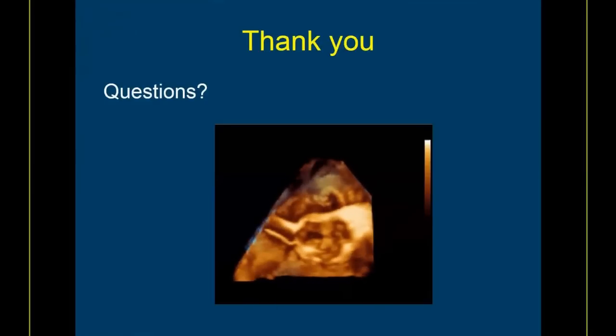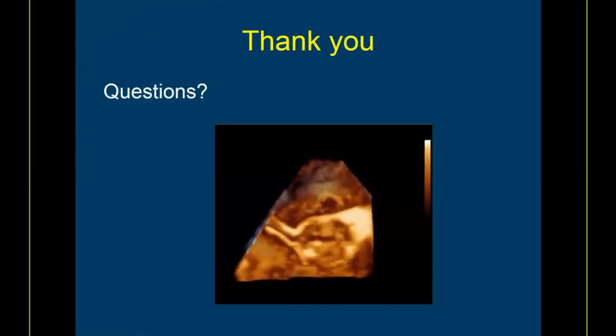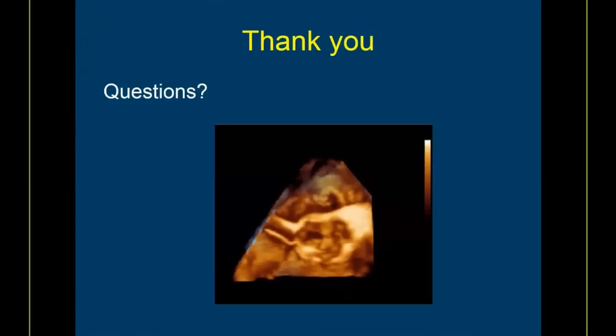Another question is, is the stroke volume index affected by obesity, especially morbid obesity? Typically the way we index cardiac chambers has been body surface area. And yes, body surface area will be affected by obesity. It's a height and weight calculation, right? That's all a BSA is.